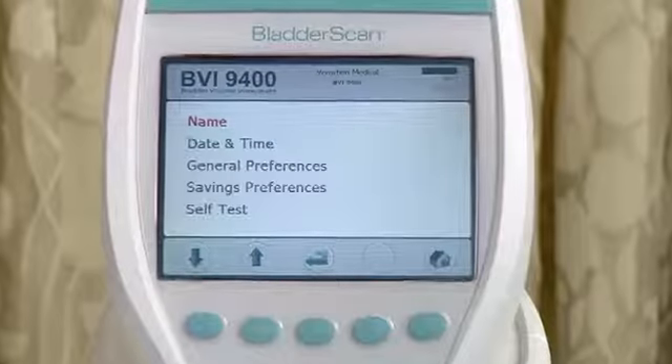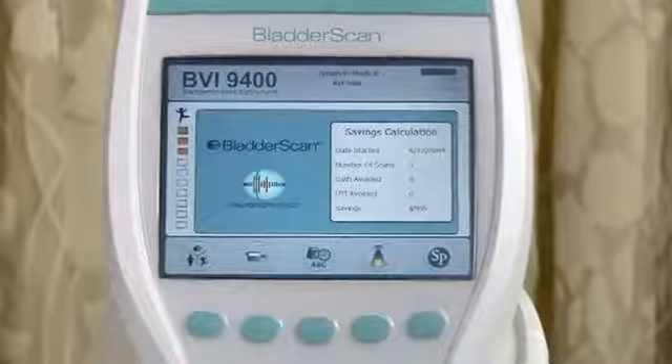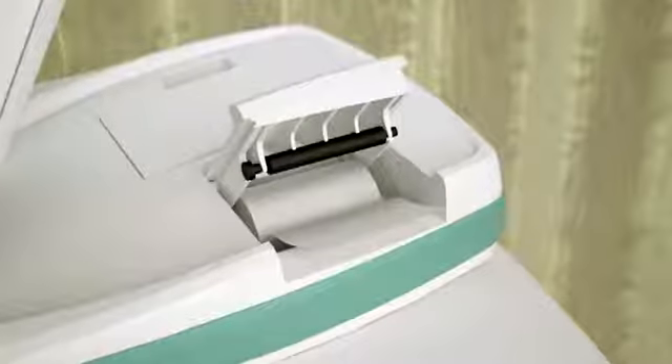Before using the bladder scan, personalize the instrument with the name of your practice and the correct time and date, as this information will be shown on all printouts. Check to make sure the battery is charged and there is enough paper in the printer before you start to scan a patient.